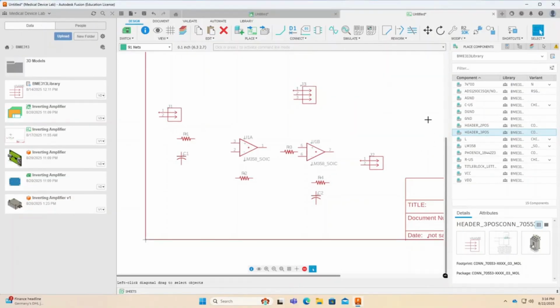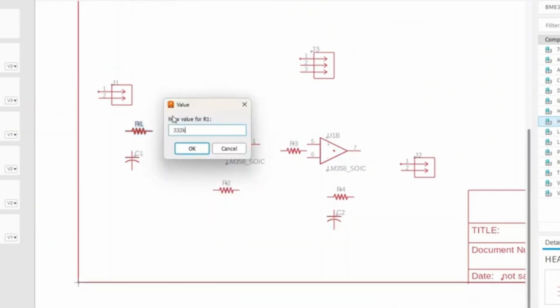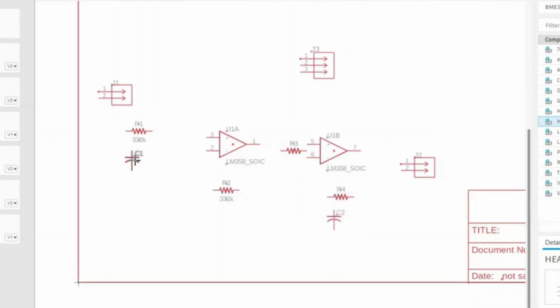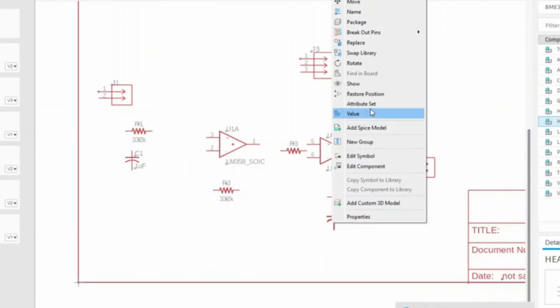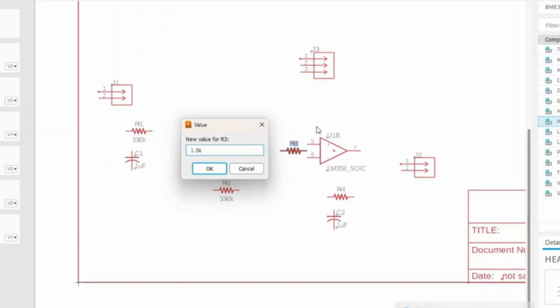Now assign component values. R1 and R2 are for the high-pass filter, so set both to 332 kiloohms. Right-click the resistor and select value to set the resistance. Set C1 and C2 to 1 microfarad. Right-click the capacitor and select value to set the capacitance. R3 and R4 are for the low-pass filter, so set both to 1.5 kiloohms. Right-click the resistor and select value to set the resistance.